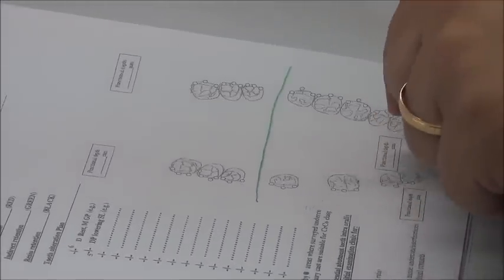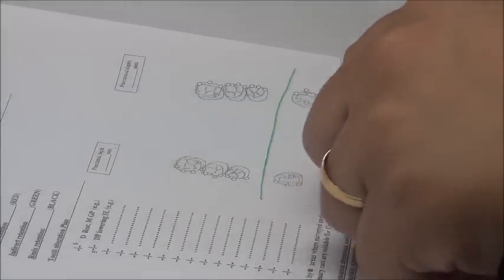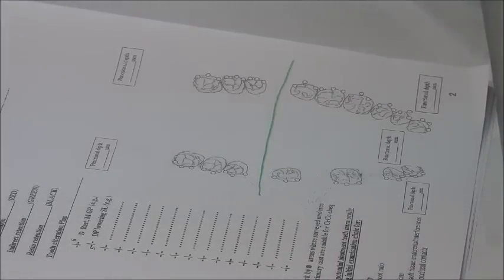Okay, I'll make it all one side. Here I have a lingual plate and a connector here. A lingual bar in the anterior area, a plate, but it goes like a bar on the posterior areas, and that's it. Can I do that? What?